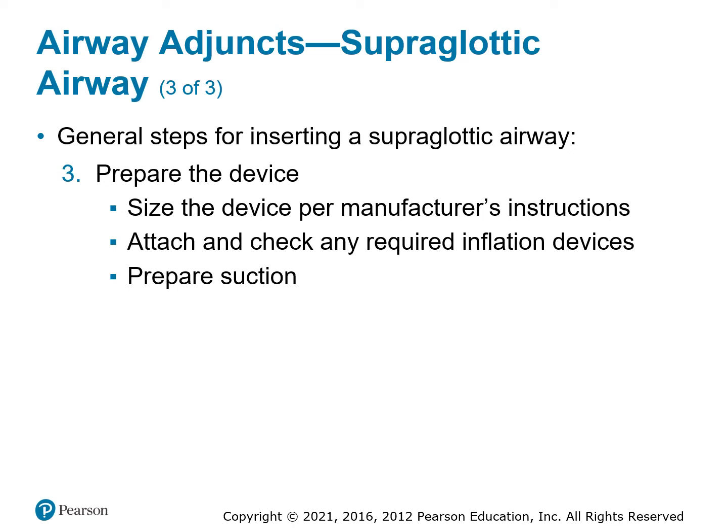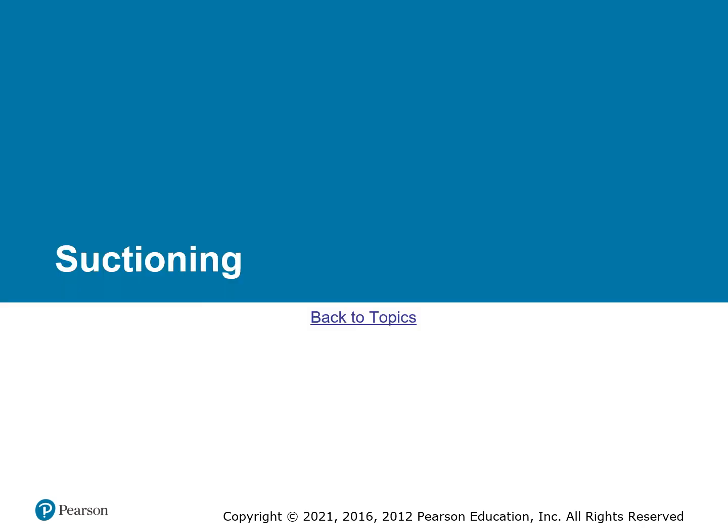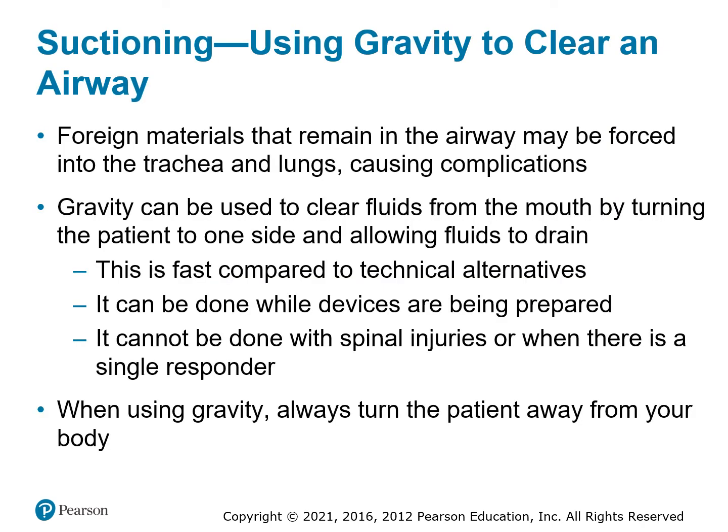You need to have suction ready, because this is going into their mouth. Same rule applies with the OPA. If they start to have a gag, you can't continue this airway. Suctioning. Foreign materials in the airway need to be suctioned out.